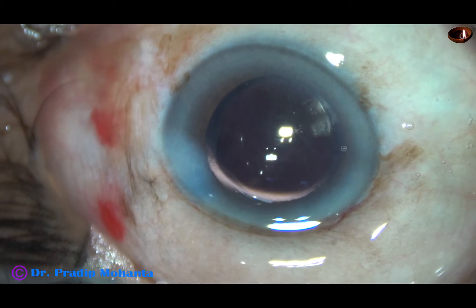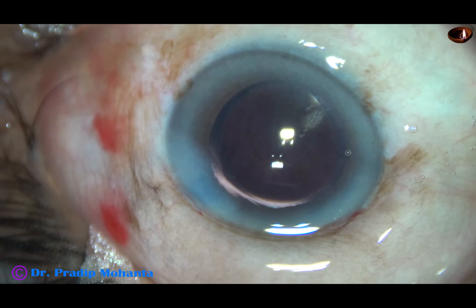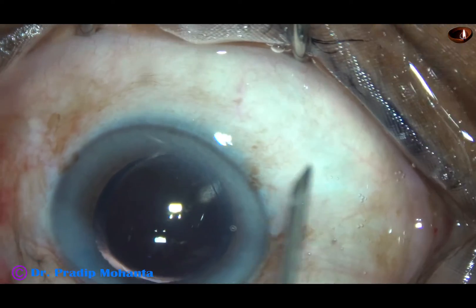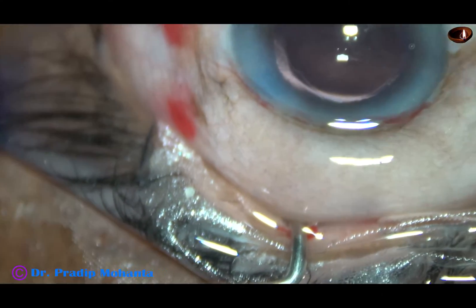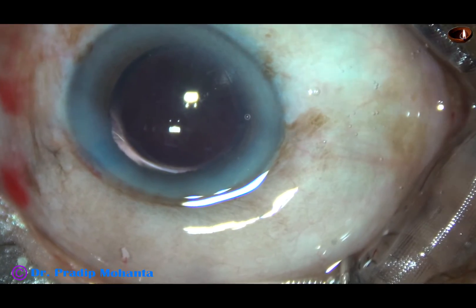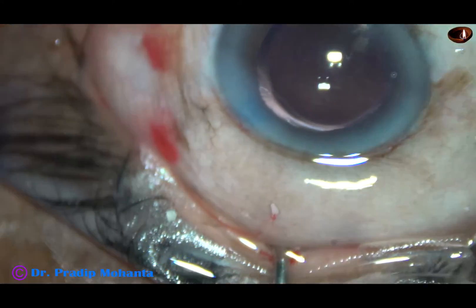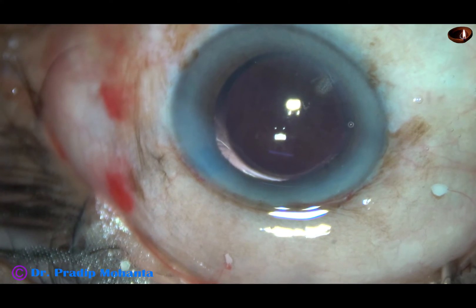One more thing has happened — there is conjunctival chemosis in this case. I am going to use an 18-gauge needle to make three punctures onto the chemosed conjunctiva to release the fluid. This is one puncture, this is another one about 180 degrees away, and this is another puncture about 90 degrees away. This fluid will drain out very quickly — we don't have to express out the fluid; it will come out in a few minutes.